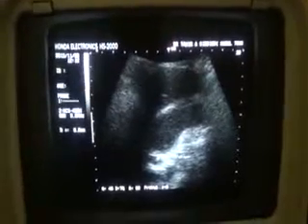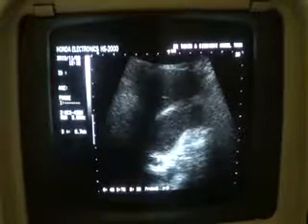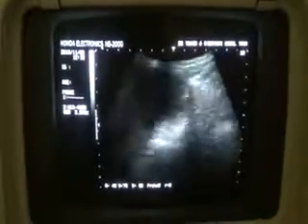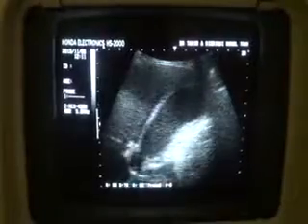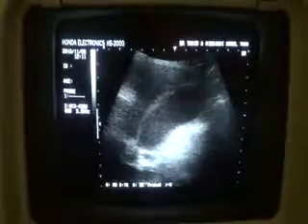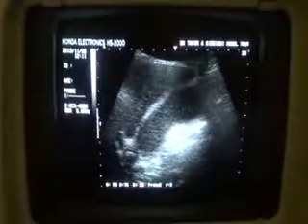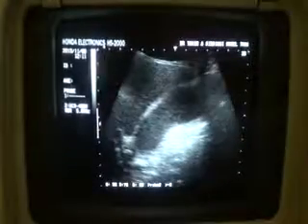This is the portal vein. This is the common bile duct running anterior to the portal vein, having echogenic borders, measuring 6.7 millimeters — up to 7 is considered normal. So this is a case of cholecystitis with distending mucocele of the gallbladder. Thank you.